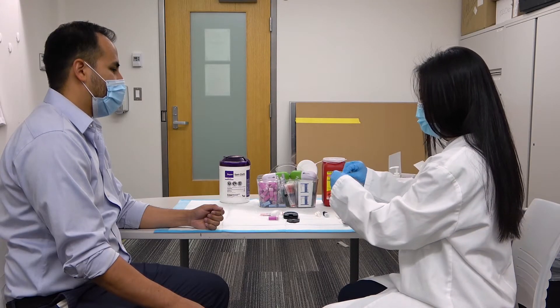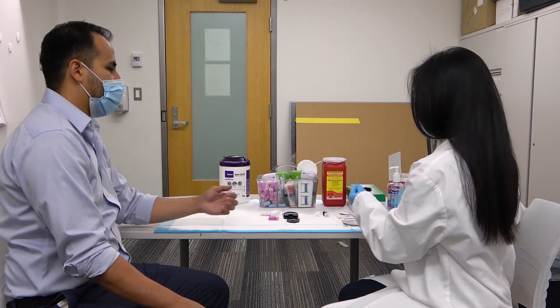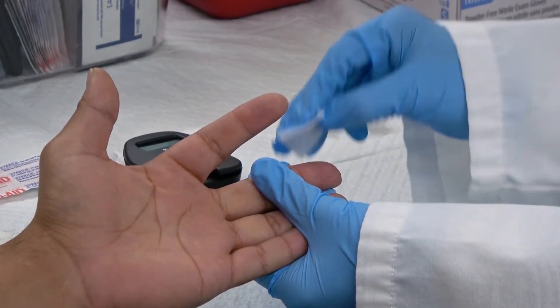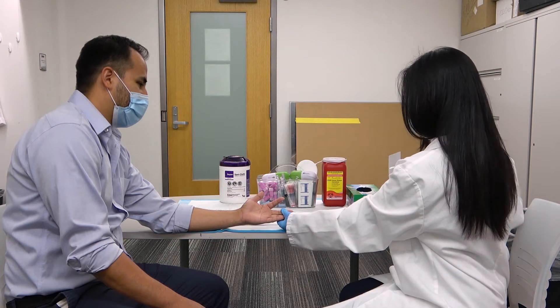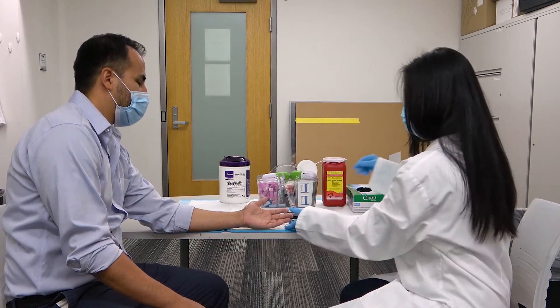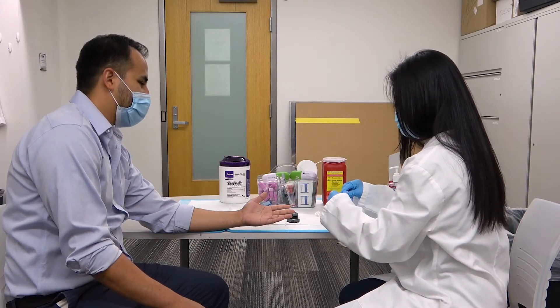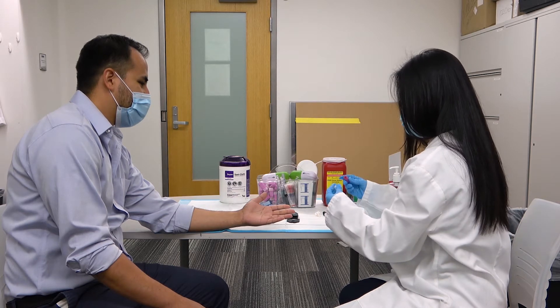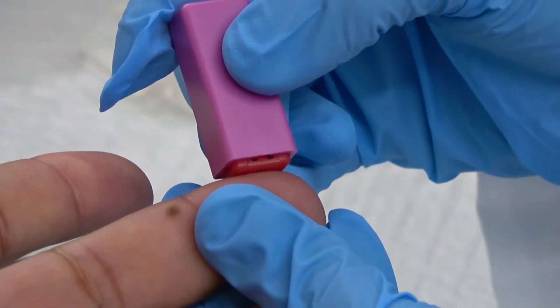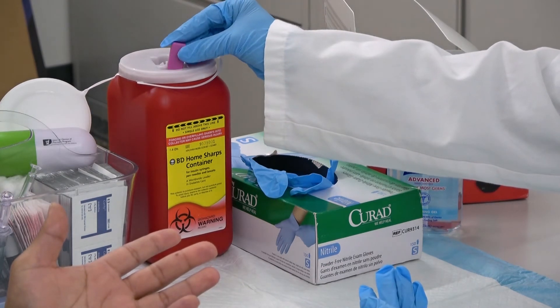Open the alcohol swab and swab the patient's finger where the sample will be collected. Remove the lancet cap and puncture the patient's finger. Discard the lancet into a sharps container.